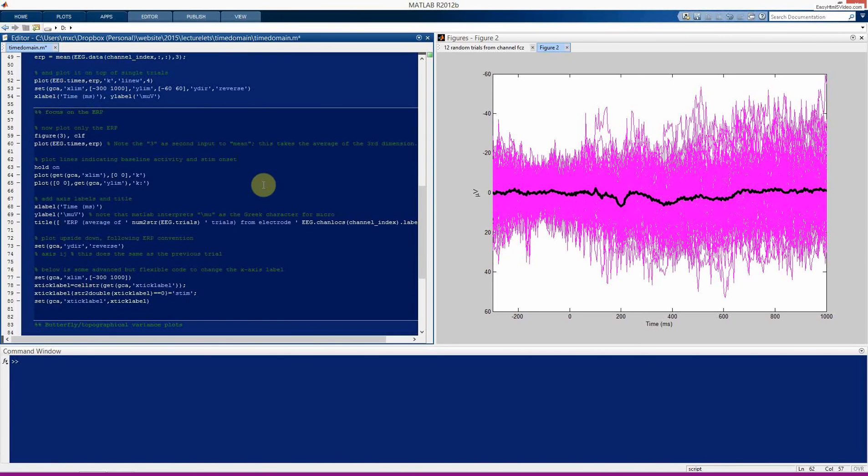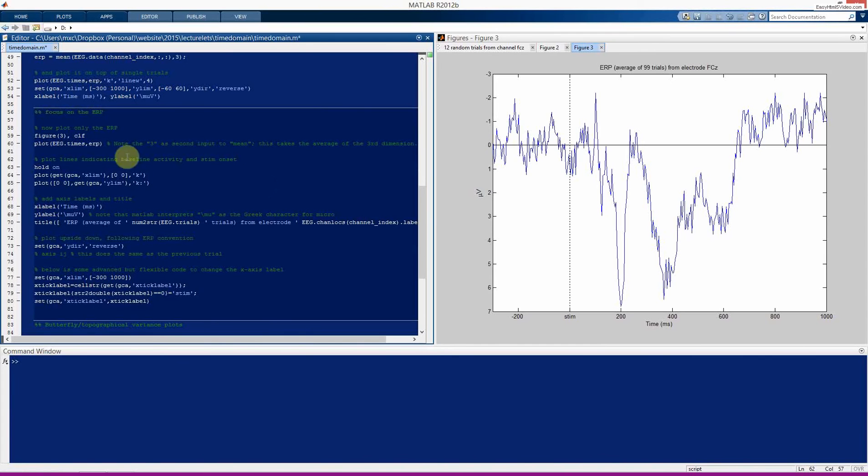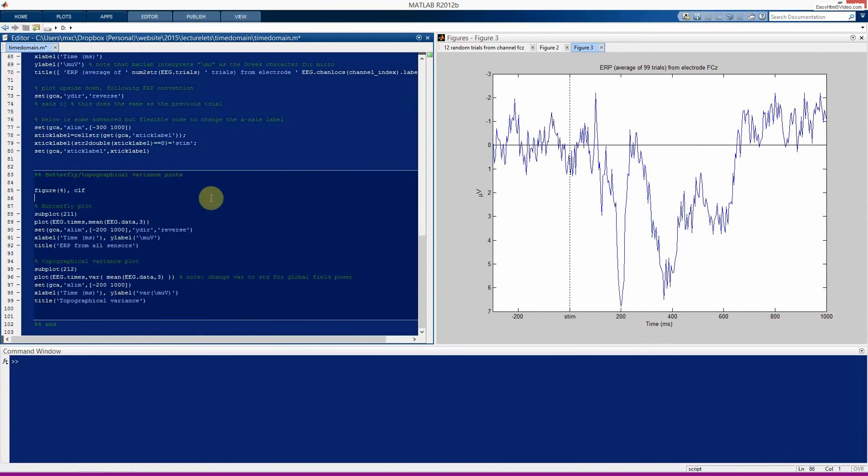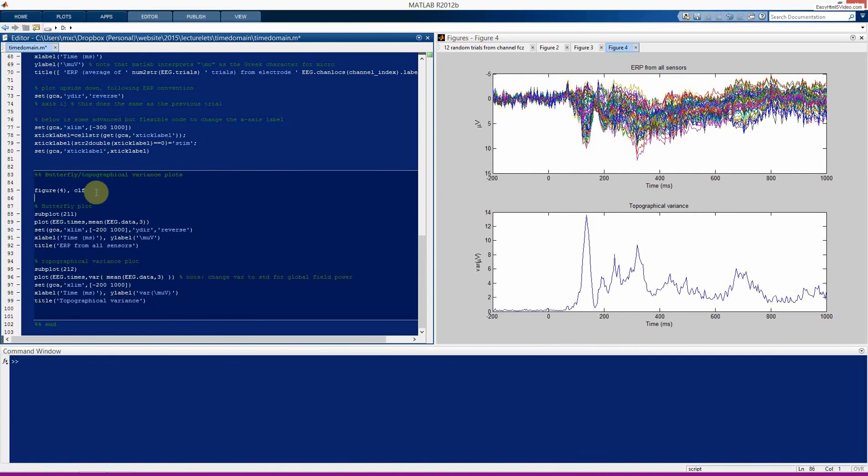So the next figure is nothing really that interesting. We are plotting the ERP again, this time without all the single trials. I have this code here, mainly in case you were interested in how to do some more slightly advanced plotting things like adding these lines and changing this from zero to stim, and so on. And now here, we are going to create the butterfly plot and the topographical variance plot, you can see this just reproduces the figure I had in the PowerPoint.